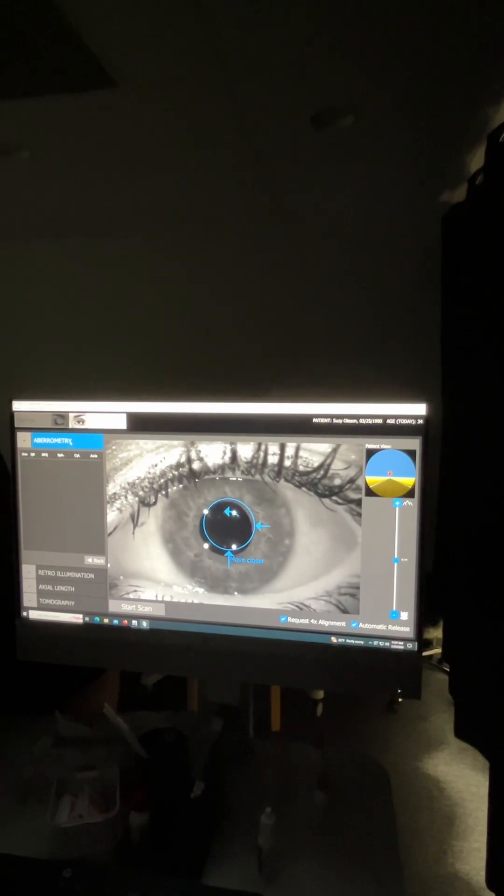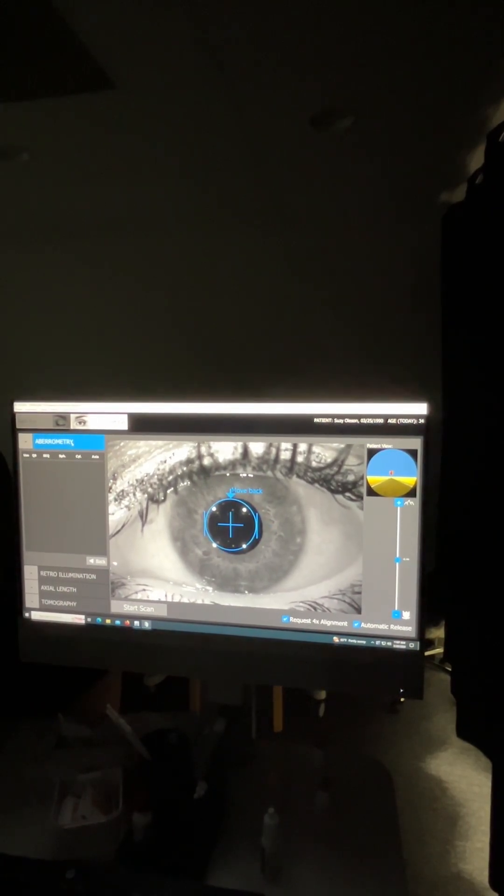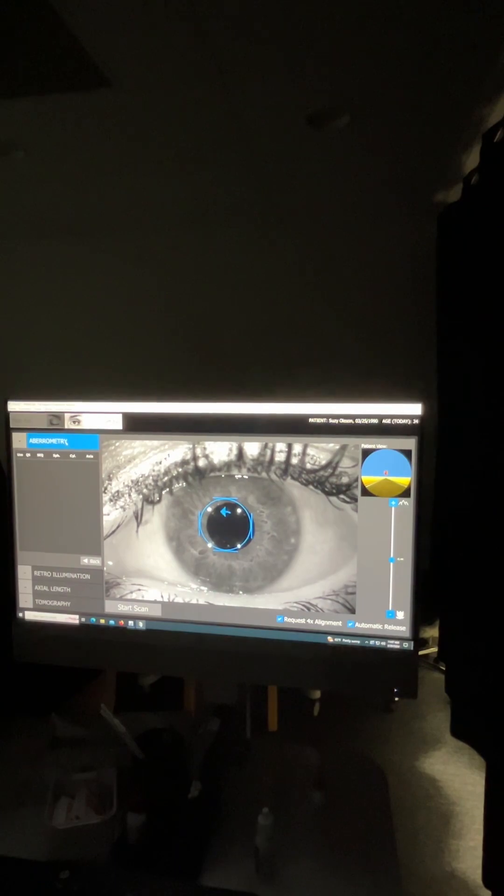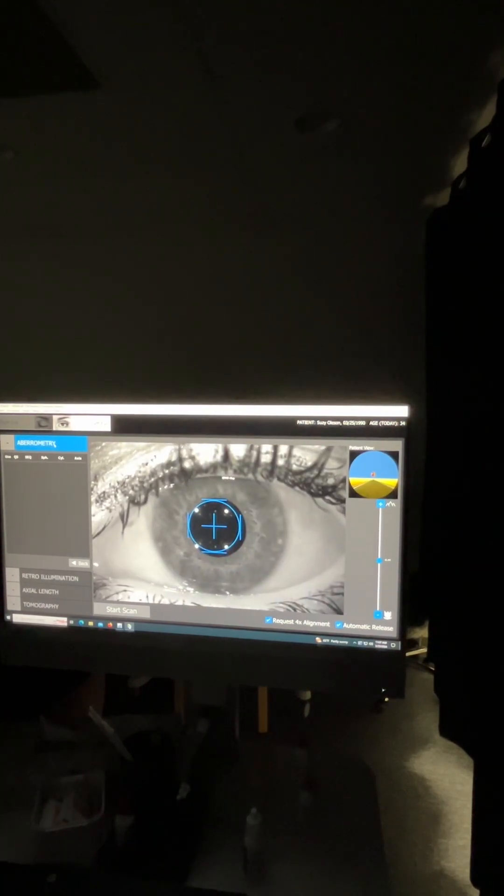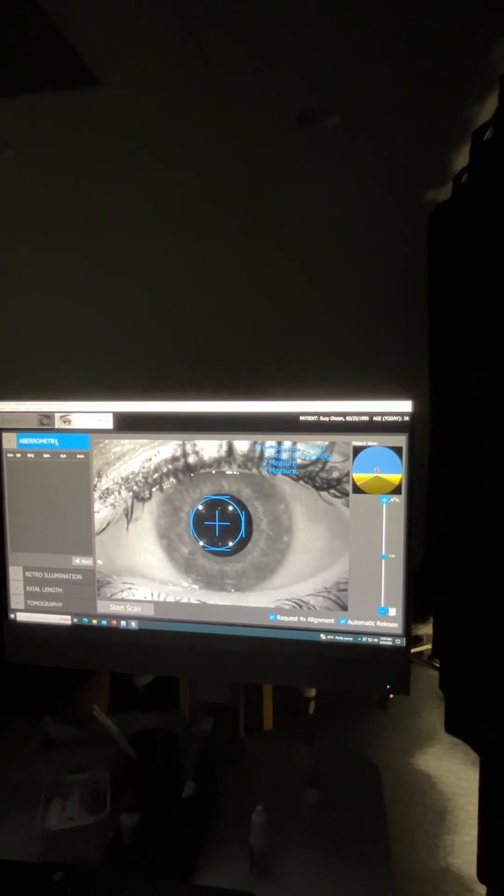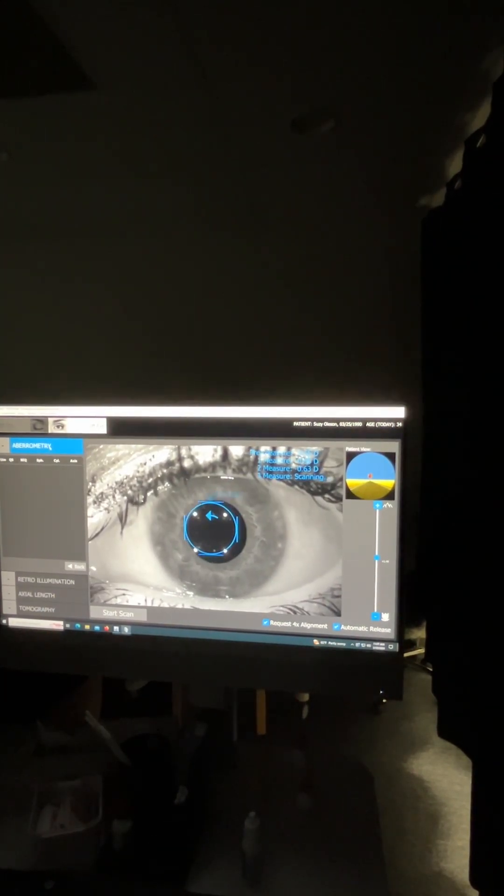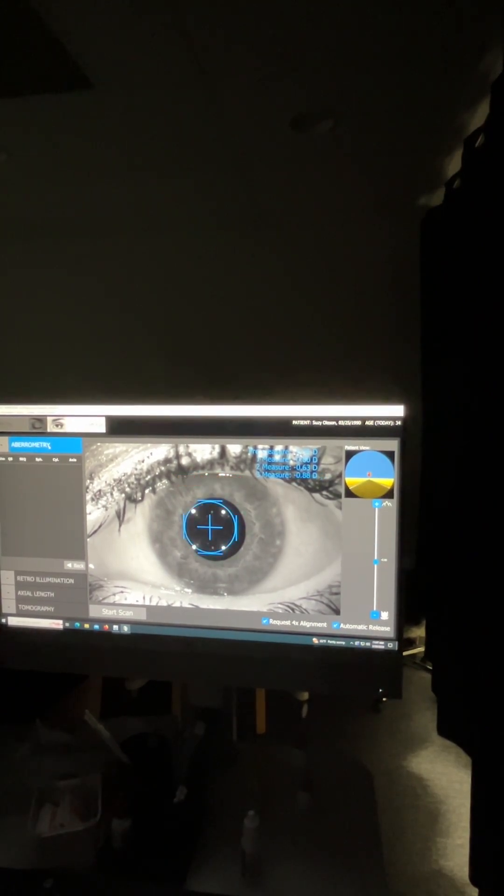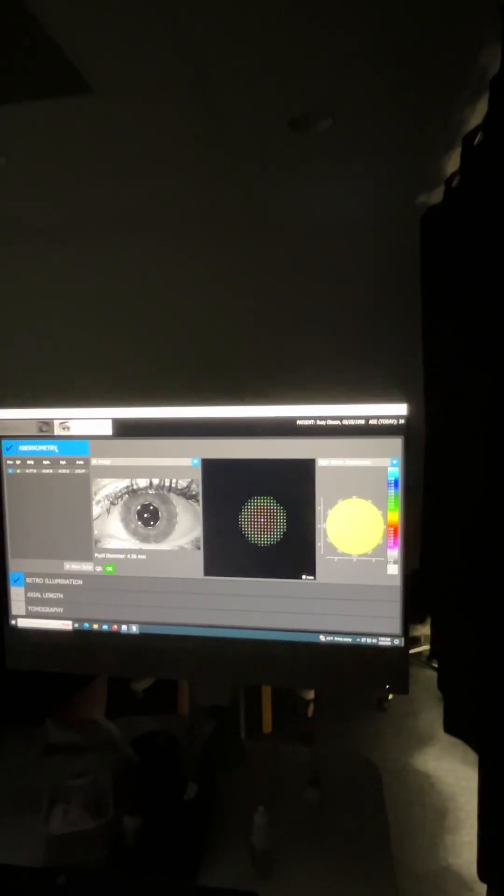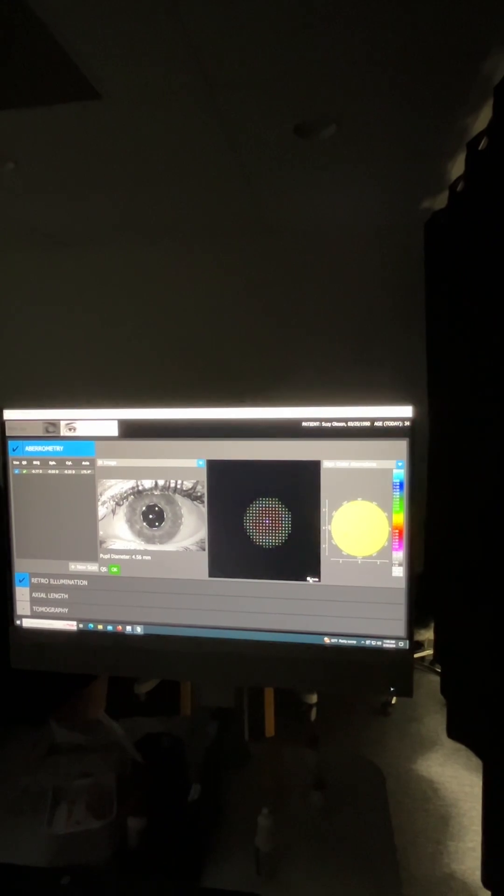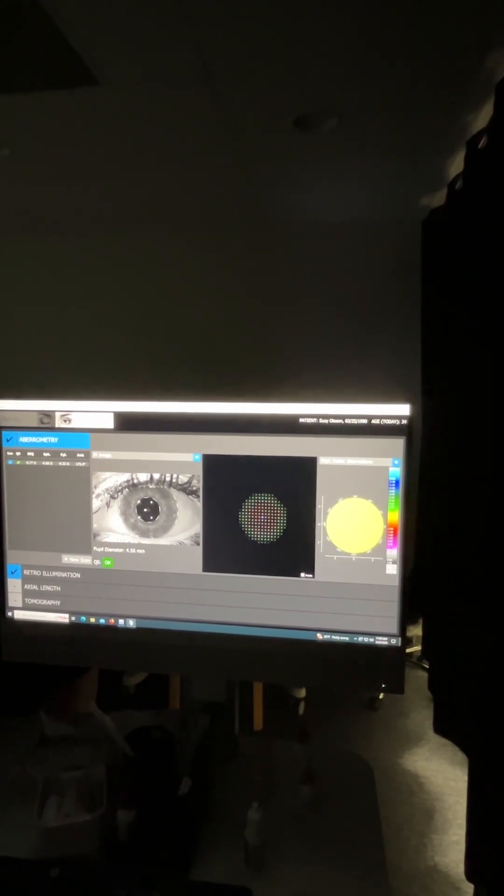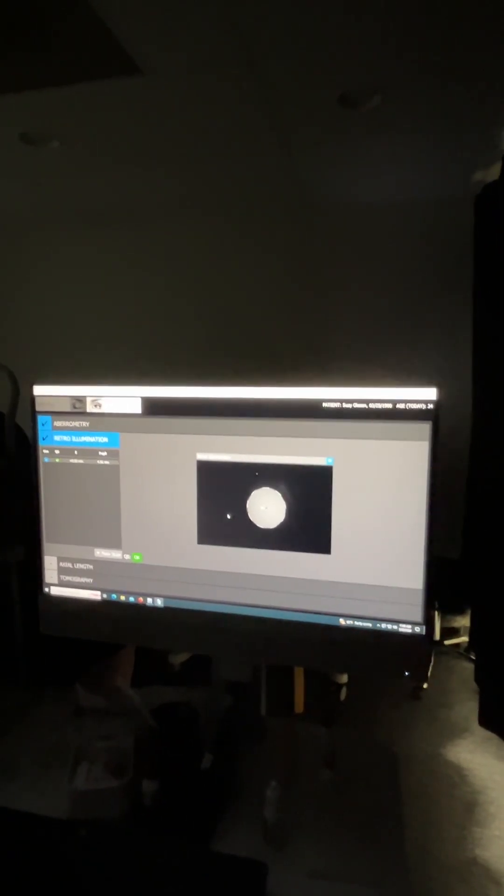Susie, let the hot air balloon come in and out of focus. This is the most sensitive of the tests. Okay. Good. Just like before, it'll give us our pupil size in the dark, scotopic pupil. You can also look at the blood vessels in any of these views. You can look at the quality of your Shack-Hartmann aberrometry. Again, Susie has very minimal aberrations, very minimal prescription as well. We'll check our retro illumination, which came out looking very good.